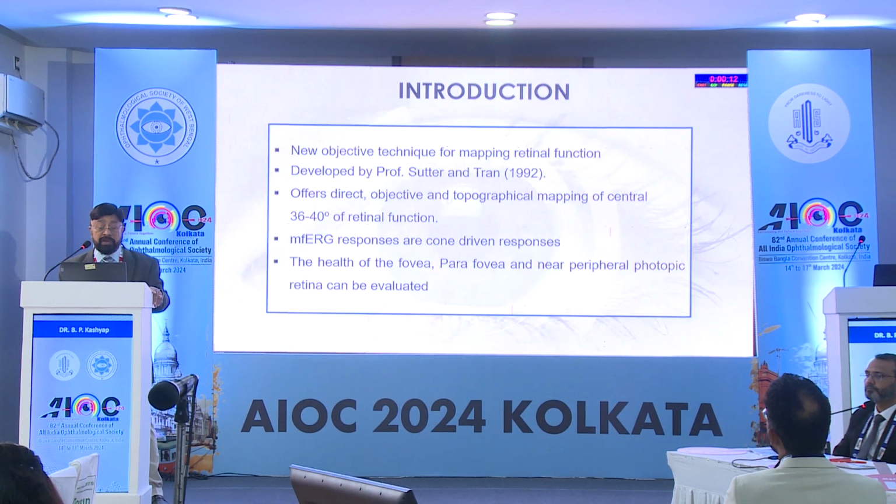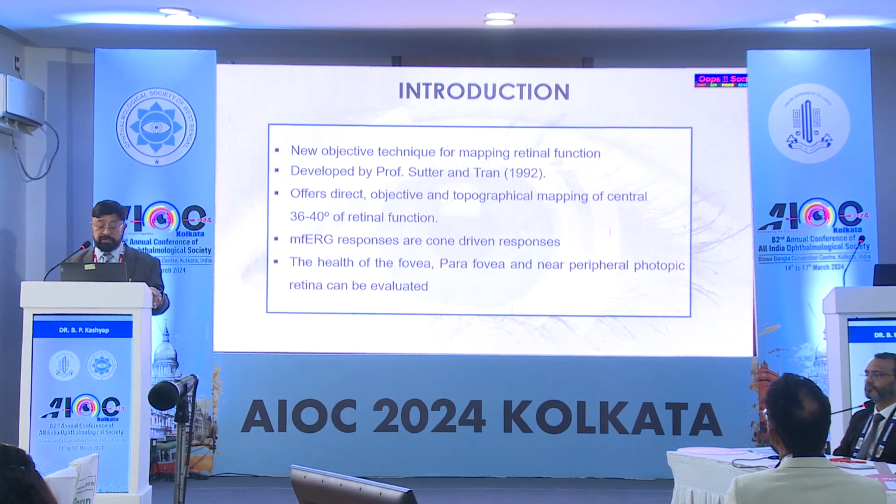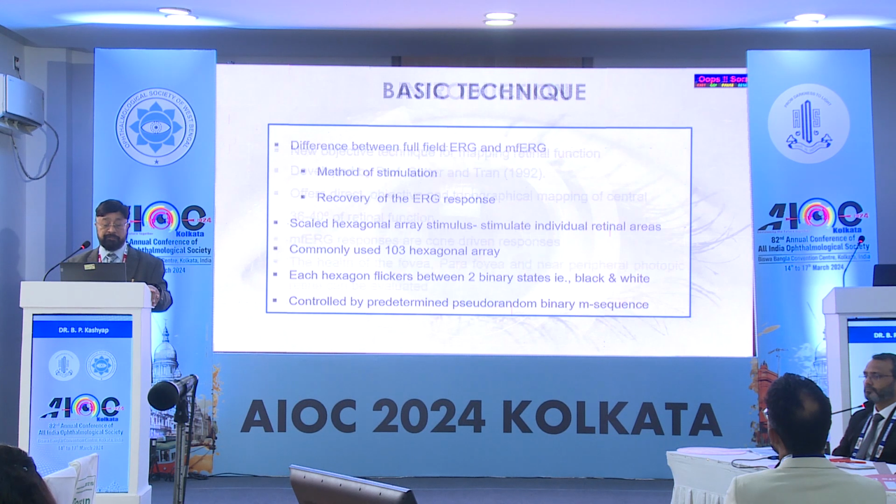Multifocal ERG is a relatively newer thing, and it basically takes care of the central portion, that is 0 degree to 36 to 40 degree, almost going to near mid-periphery. It is basically the cone-driven response, and it tells you the health of the fovea center, parafovea, and near peripheral photopic retina.